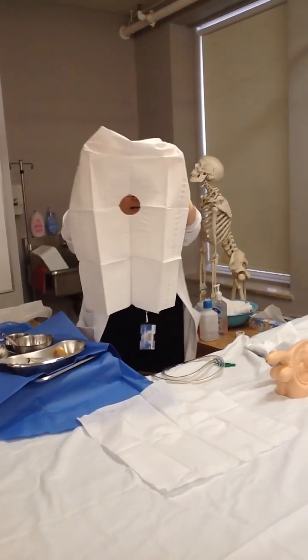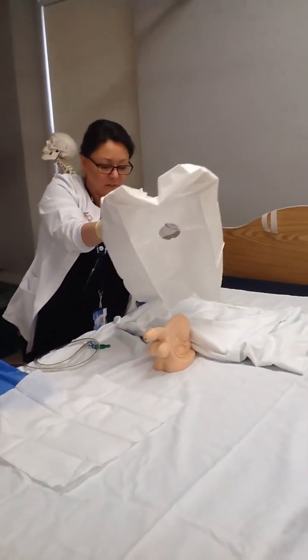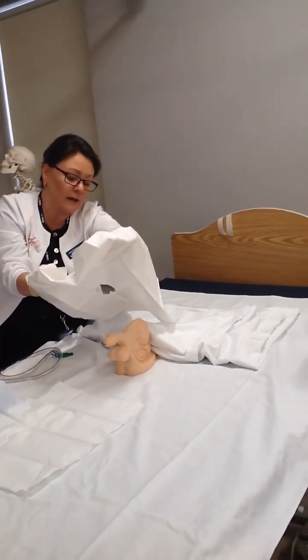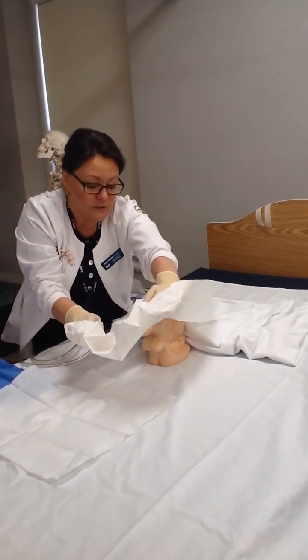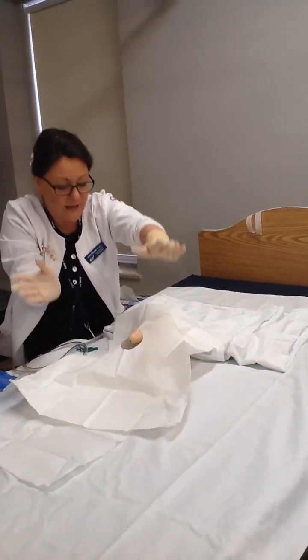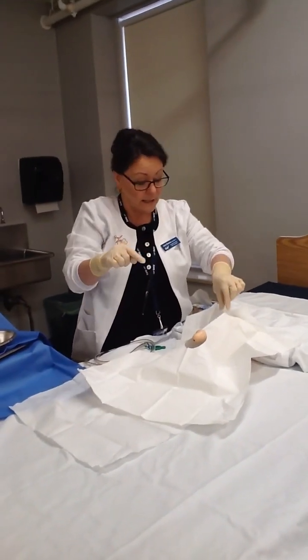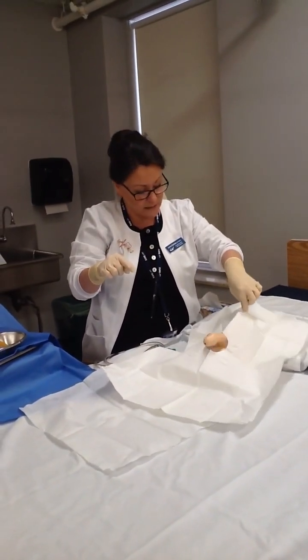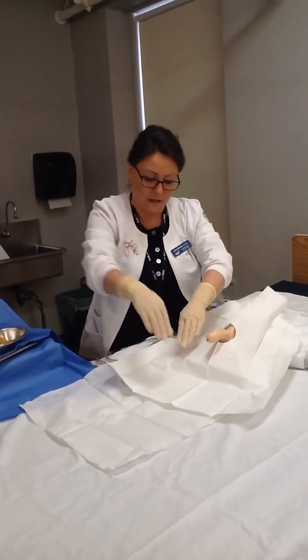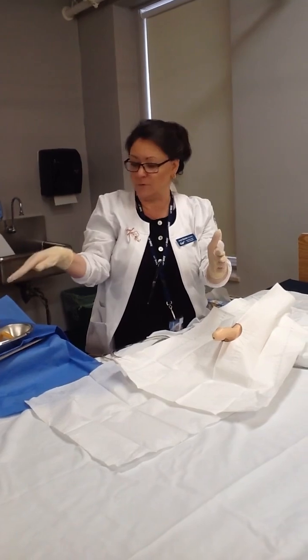I'm going to advance above the patient's genitalia and start laying that drape down. I'm going to look through that hole, get it over the patient's genitalia, and flick that out. Again, I have a 1 inch unsterile border, and I'm going to pull that to suit me. I've created this great big sterile field for me to move my items down.